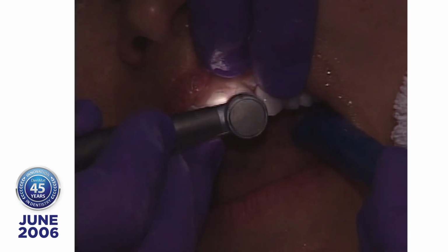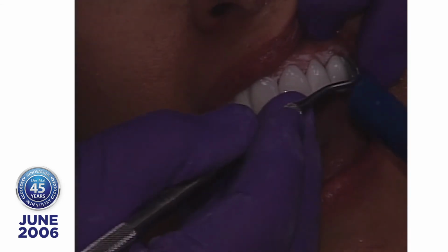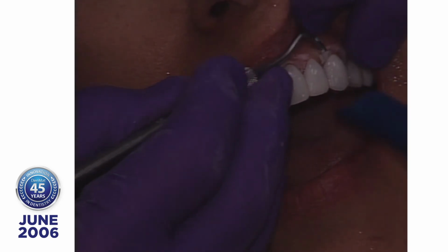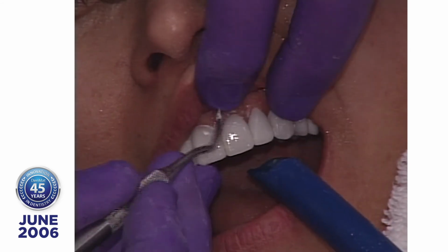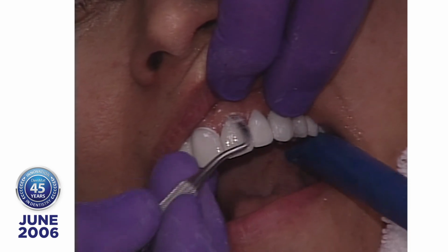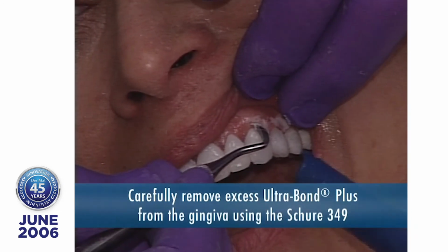And there's another reason I don't like to show the patient all of the Lumineers tried in. They never look as good on the try-in when you put them all in as they will after you start cleaning up these embrasures. So patients start looking for what's wrong, and they start to have a negative attitude. And then all of a sudden you spend all your time trying to convince them why what you did is okay.